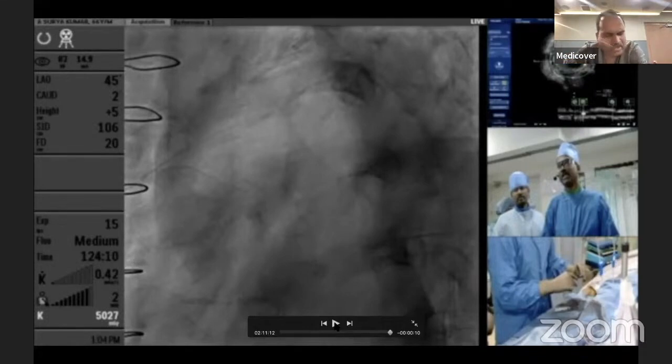No, it generally won't clear off, and your entire subintimal space may not be delineated by contrast as well, because when there is no outflow from the subintimal space, whatever contrast you are giving won't reach your entire subintimal space. You only see some proximal portion, and the rest of the portion may not be visible. But will the contrast clear or not, Sharath? Will it become like a no flow contrast injection, or will it clear out subsequently over a few heartbeats? After a few heartbeats, yes, it may get cleared off.